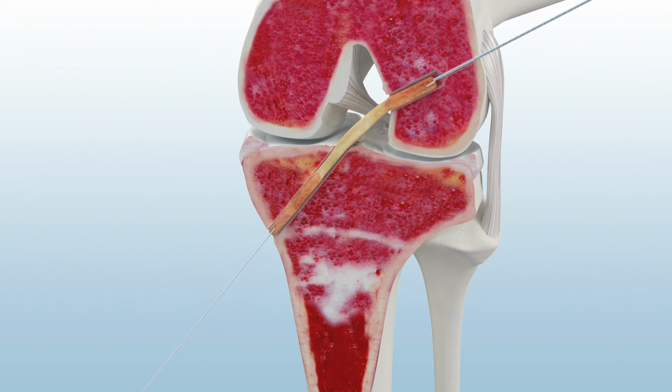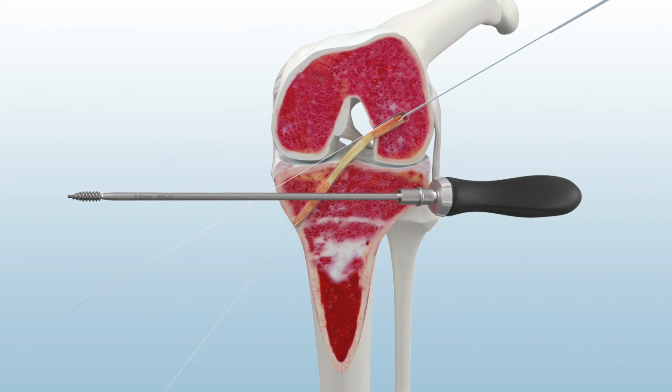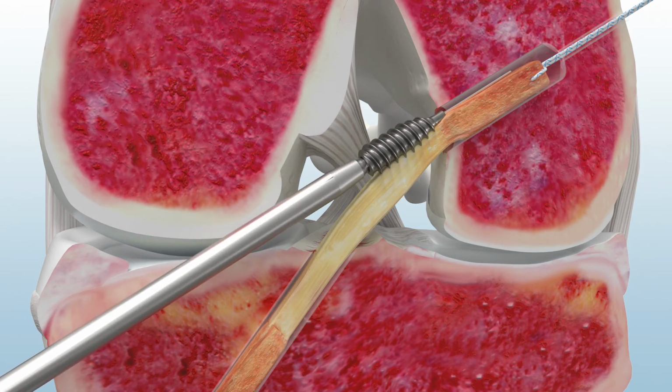Once the graft is seated, insert the hyperflex guide wire proximally between the femoral tunnel wall and the bone block. Load the Easy Start interference screw onto the 3.5mm hex driver and insert over the hyperflex guide wire. Utilize the conical tip of the screw to self-notch between the femoral tunnel and bone block.